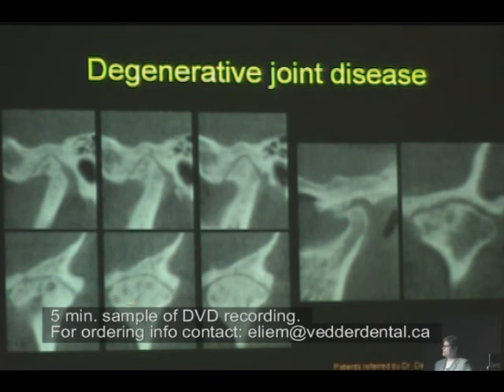These are subchondral erosions. Some of the books call these Ely cysts, named after the person who first described them, E-L-Y. And they're not a true cyst. Remember, a cyst is an epithelial-lined cavity filled with fluid. They're not a cyst, but they're called a cyst because radiographically they are very round, radiolucent, and well-defined. So they look cyst-like in a radiograph.